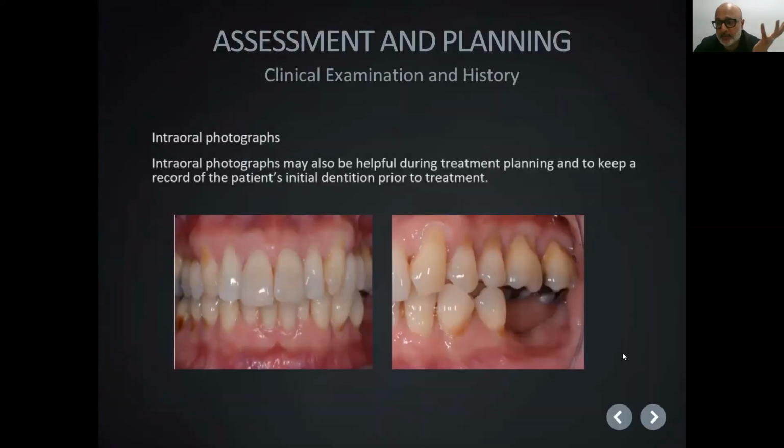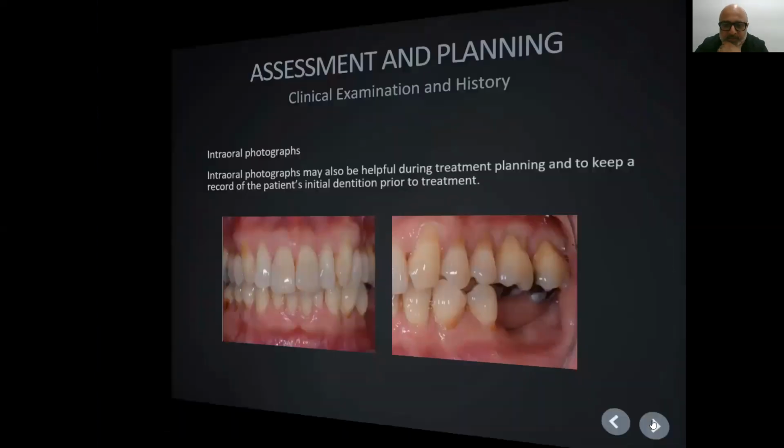And also it's less susceptible to recession. Okay, intraoral photographs, very important. They keep a record. We still take them, even though we have a few scanners at our practice, but it's still just as important because photographs are photographs. Scans are great, but they are different.